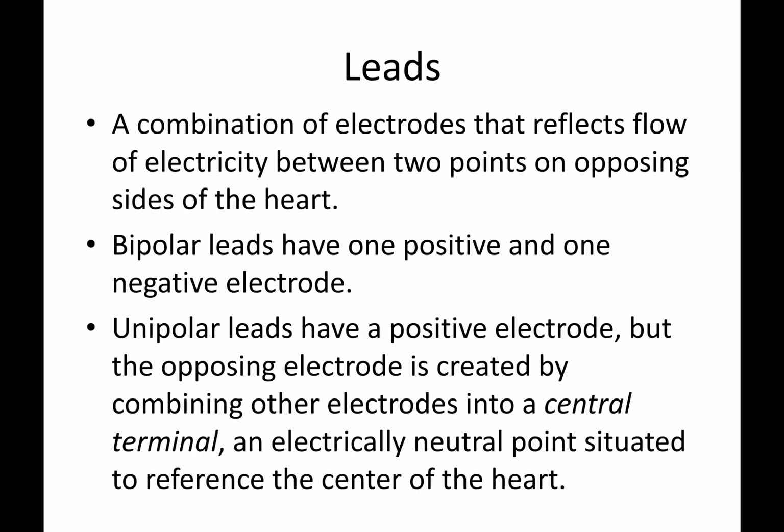Leads. This next section's a little detailed, but I'm going to try and keep it as brief as possible. We're going to focus on what the leads represent, not how to put the stickers on. What I want you to realize is how the layout of these leads, not just our typical chest leads, or not our typical limb leads, but adding those with the chest can help create a really great three-dimensional picture of the heart with a nice single test.